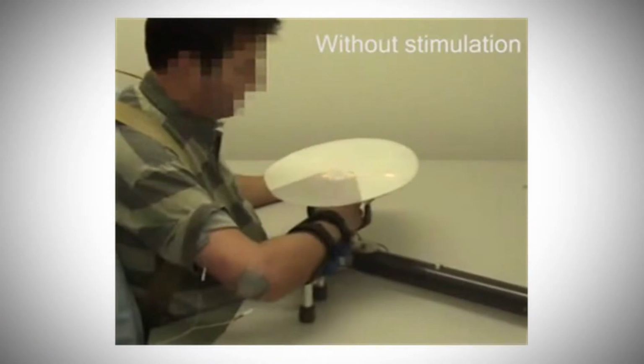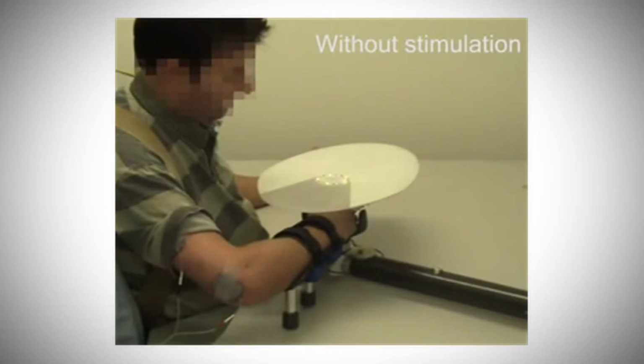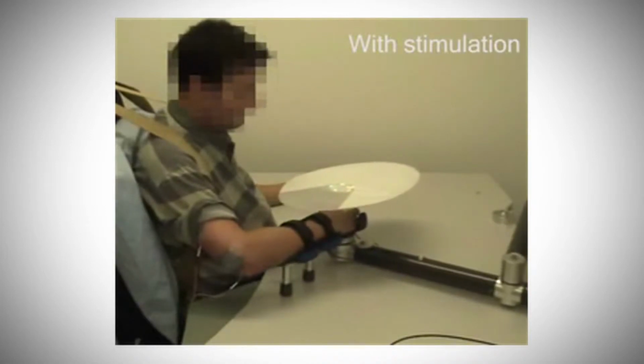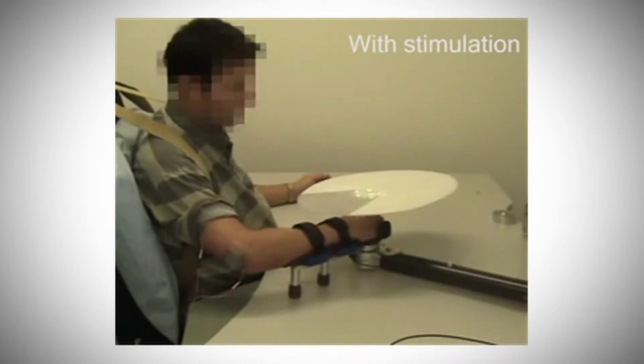And we built a very simple robot which would enable somebody to follow a very simple tracking signal. The way we made this work was that we provided some stimulation, and they tried to follow the tracking signal. And then the robot knew how well they'd followed it. With that information, we could change the stimulation to try and make it more accurate. So each time they did it, the stimulation was adjusted based on what they'd done before, so that the tracking was more accurate. And they would practice it many, many times, gradually getting more and more accurate.